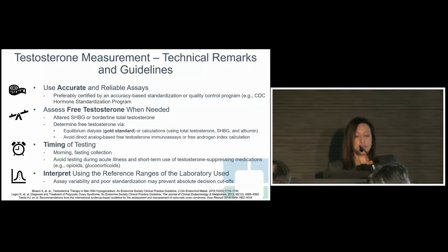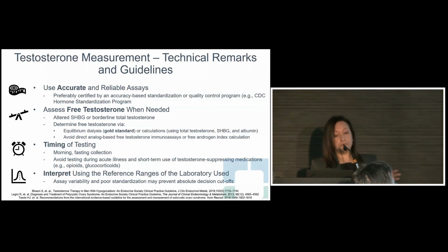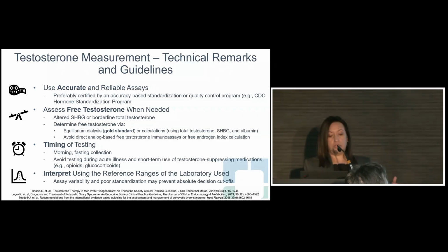They also state to assess free testosterone when needed, and there's one main condition: the alteration of sex hormone binding globulin or borderline total testosterone.